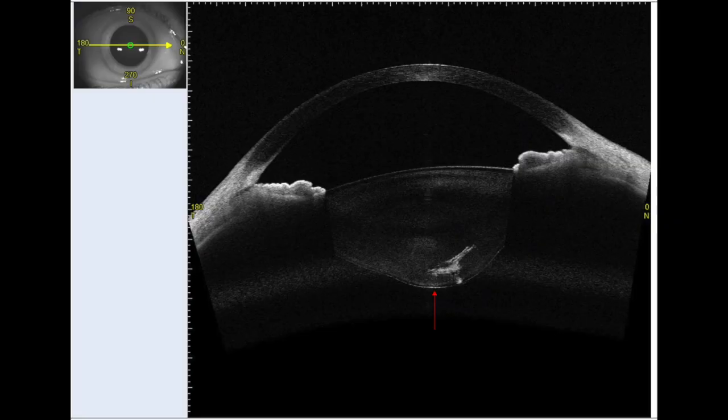On focal slit lamp examination after dilation, there appears a circumscribed circular bulge in the posterior capsule. This bulge is more evident on the anterior segment OCT, illustrating outpouching of the posterior capsule along with some vesicular changes in the cortical fibers around the cone. The systemic examination was normal, thus the diagnosis of posterior lenticonus was made.